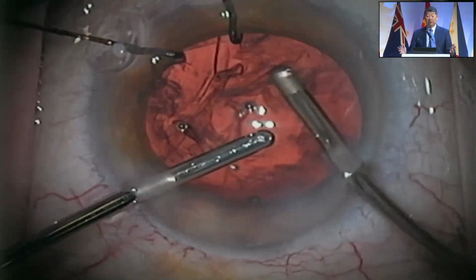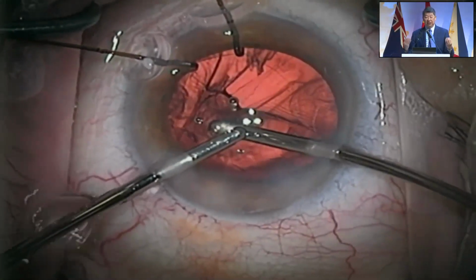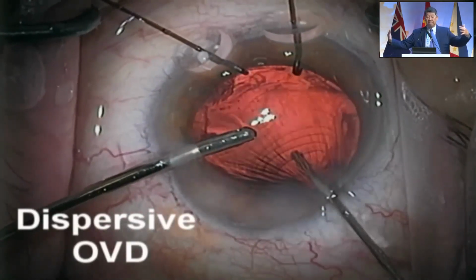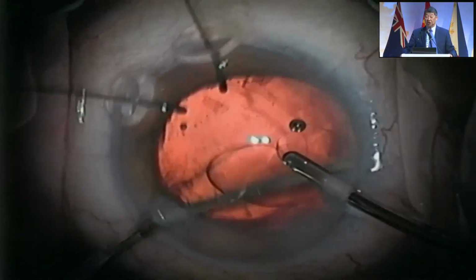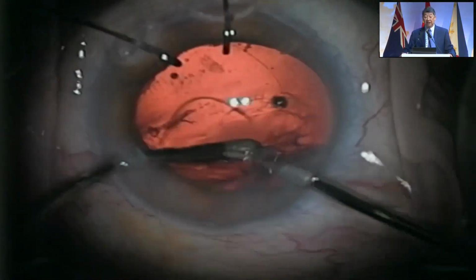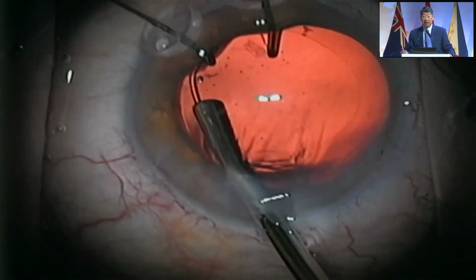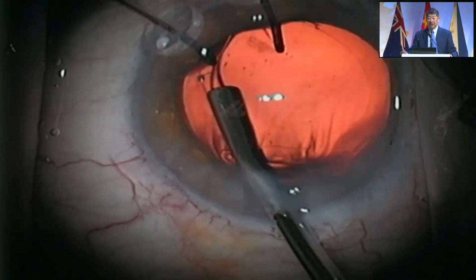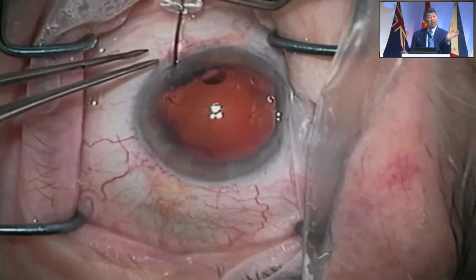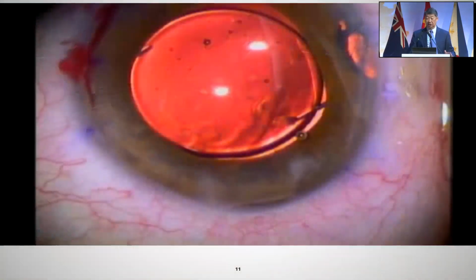And yet I don't want to put a CTR in now because that's going to trap things. So I pause and I put in a dispersive, again, to resist aspiration. And it's putting that posterior capsule on stretch, as though the zonules were strong again. And now see how that cortex separates easily. Biaxial I/A is a great choice here. And then if you don't use the spiral injector, see how I aim the CTR injector tip to the left so that it opens to the right and doesn't displace the bag.